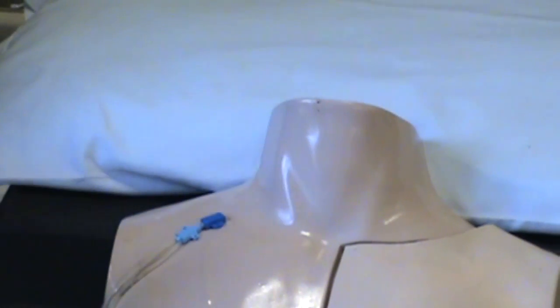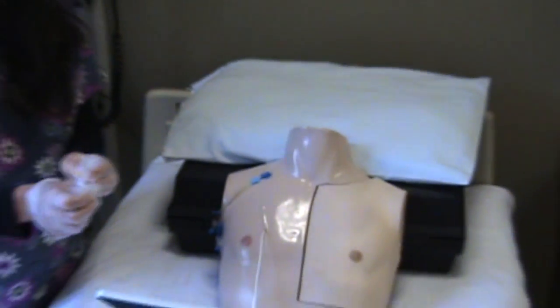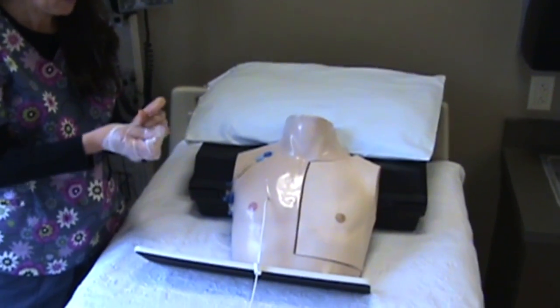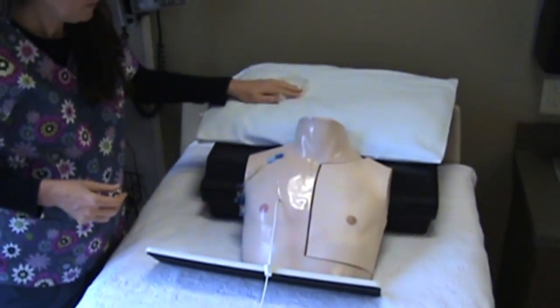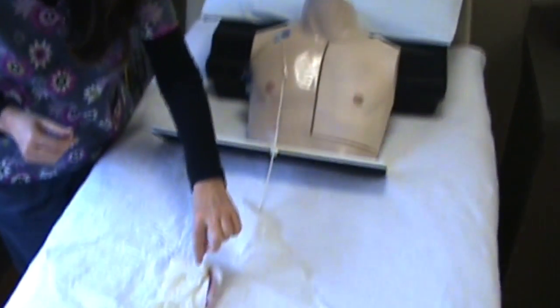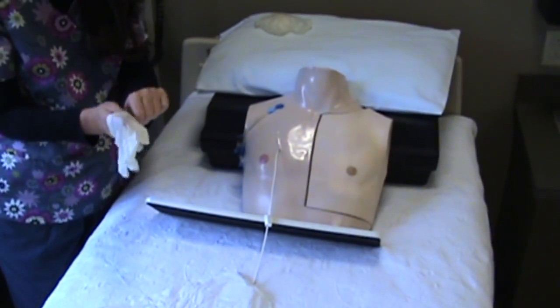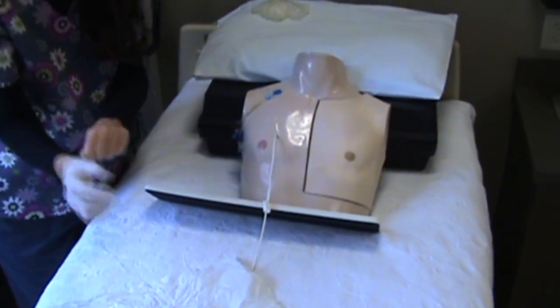Now I'm going to throw my gloves away, and immediately I'll put on clean gloves to do the dressing change, or sterile gloves.